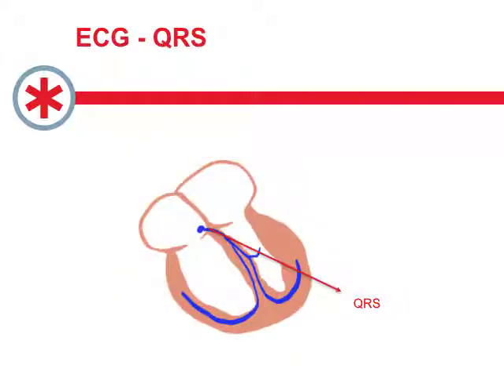And we're going to use this basically as an example for the electrical depolarization of the heart, because actually when we look at a QRS complex on our cardiogram, this is actually the direction that in a normal cardiogram the QRS's electrical complex goes. Now, I know you're looking at this beautifully drawn heart and you're thinking, shouldn't it go straight down those nice blue lines, the His-Purkinje system? But actually remember that in a QRS complex, we are looking at the depolarization of the entire heart, including the muscle cells and the like. And because the left ventricle is often bigger, has more muscle mass, the QRS kind of gets shifted up a little bit towards that left ventricle. So that's kind of the direction of our QRS depolarization.